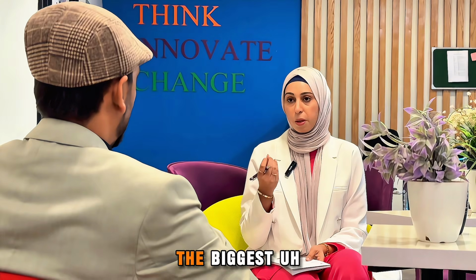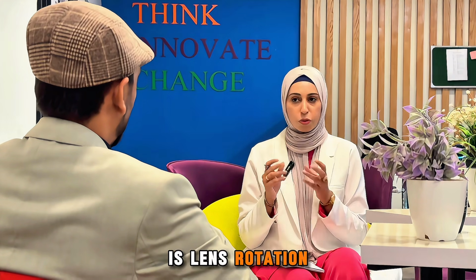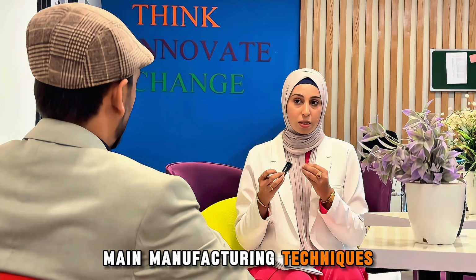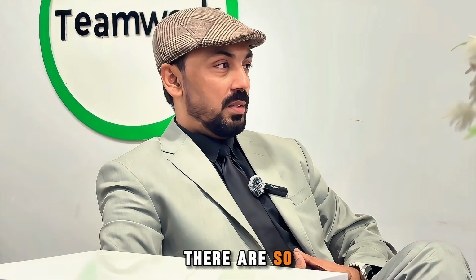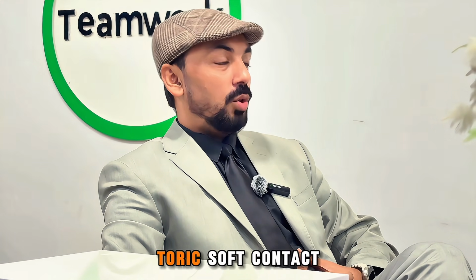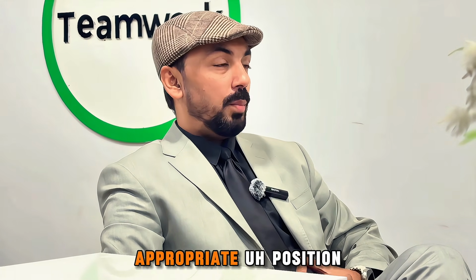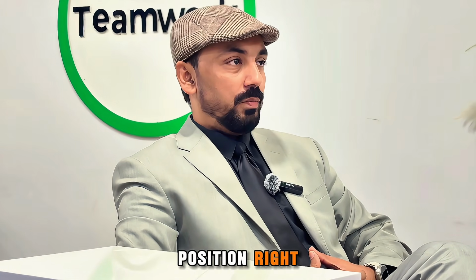Sir, as we talked about, the biggest problem in soft toric contact lens fitting is lens rotation. So what do you think, what are the main manufacturing techniques through which we can avoid lens rotation? Yes, there are so many manufacturing techniques. With the help of these techniques, the toric soft contact lens can maintain its appropriate position, which is called the 6 o'clock position, right?